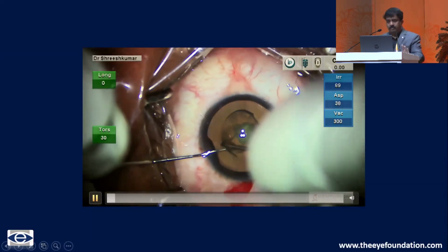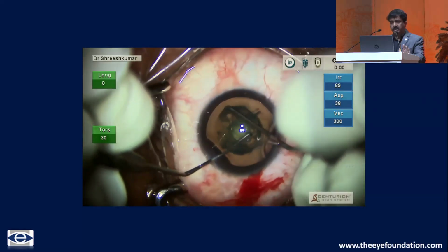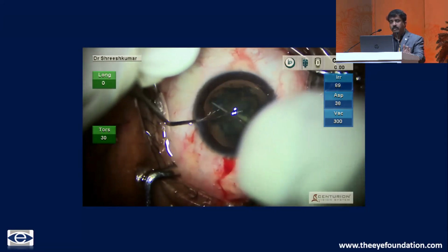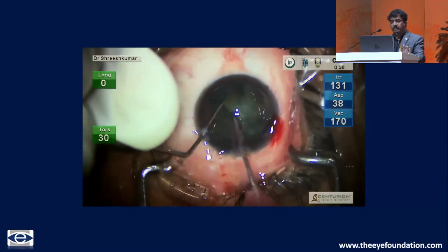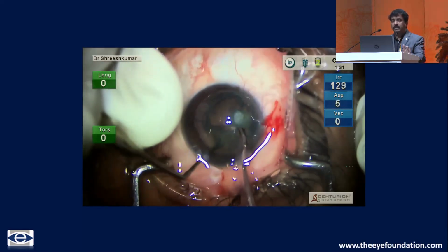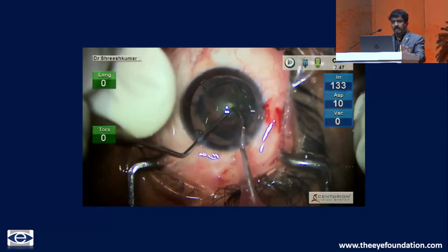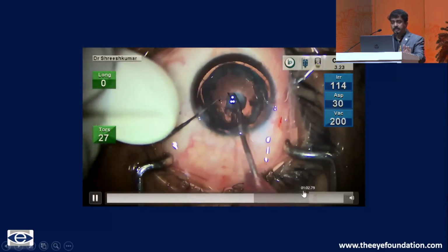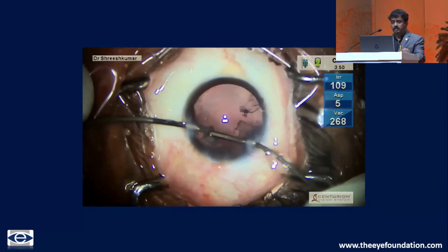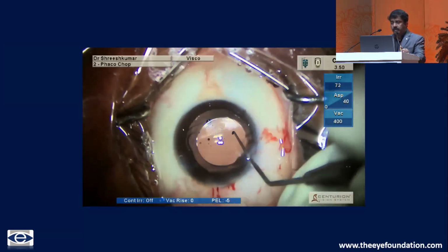This is a soft cataract, grade 1 to 2 PPC, and I am doing a mechanical delamination using a Sinskey hook. So I am delineating endonucleus from the epinucleus, and now trying to delineate epinucleus from the remaining cortex, and doing a phacoemulsification, chopping and doing the emulsification part within the epinuclear cushion. Do a layer by layer aspiration of epinucleus, cortex, and cortical cleanup. Follow all the other parameters which you usually follow, and maintain the anterior chamber. Don't allow the AC to collapse.